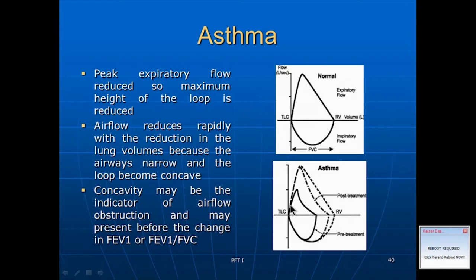After a bronchodilator treatment, the patient should improve about 15%. You take a deep breath in as quickly as possible, and you can see they get that dog-leg pattern, where they get a sharp drop and then a longer expiration.